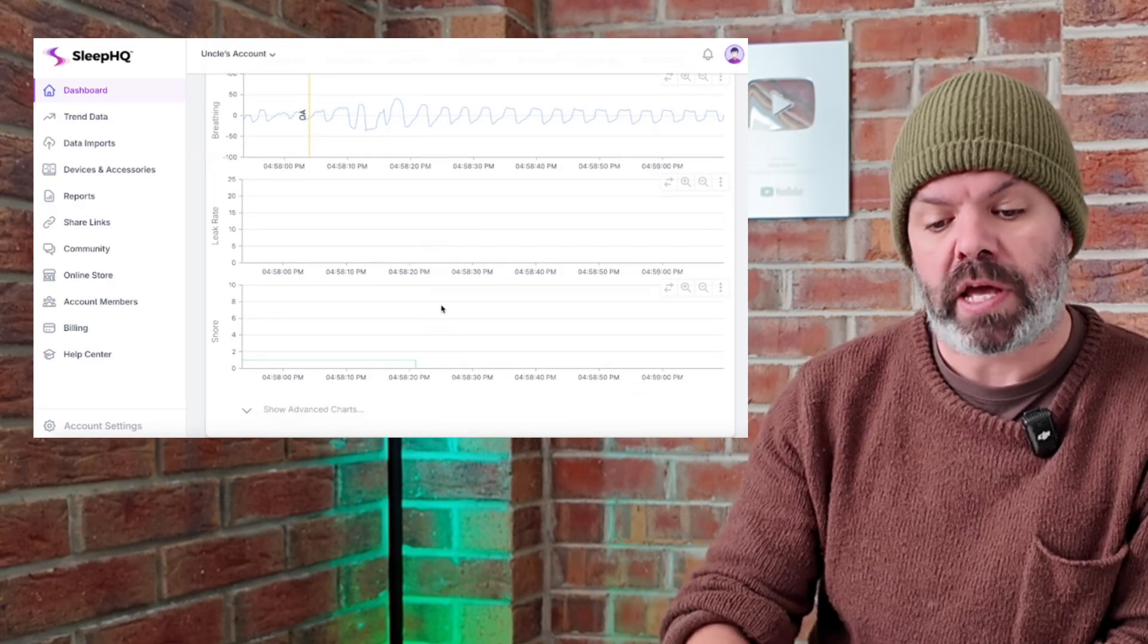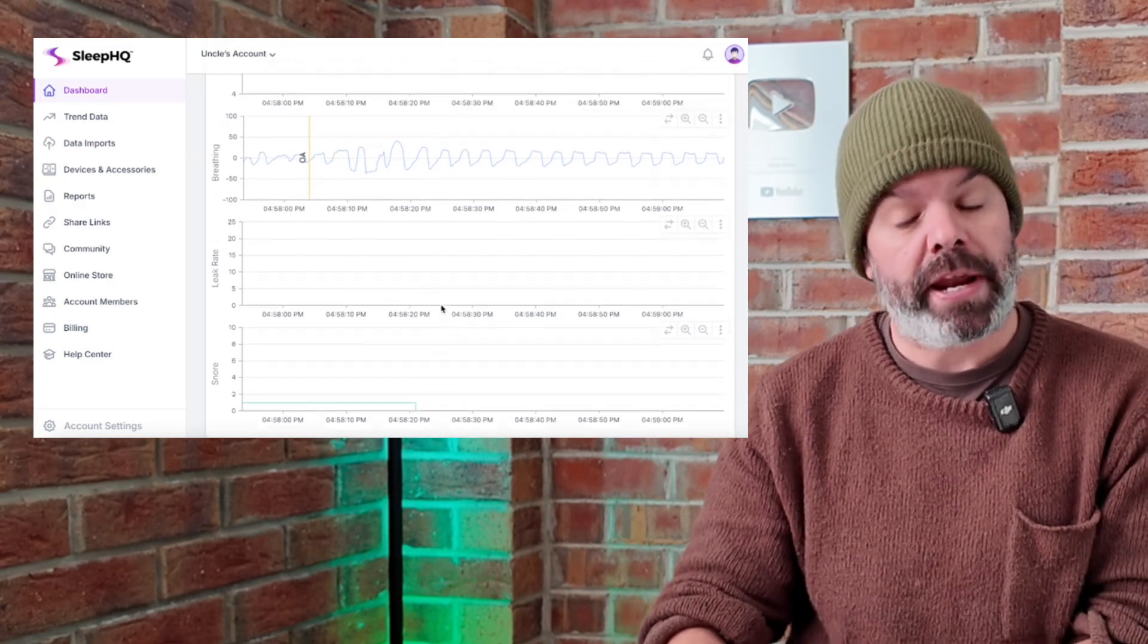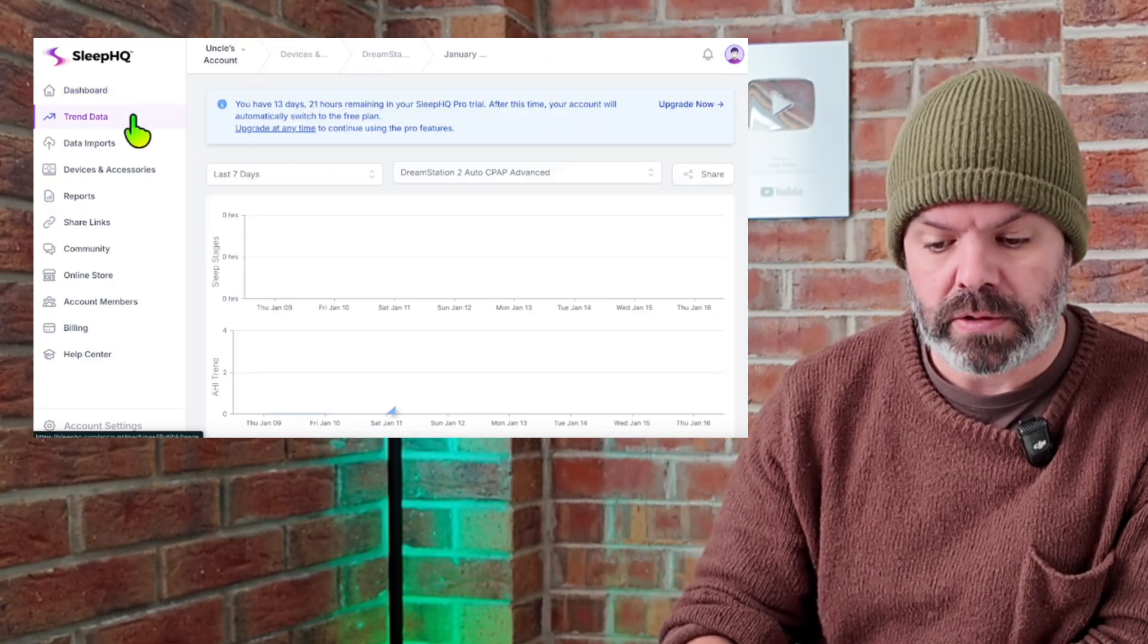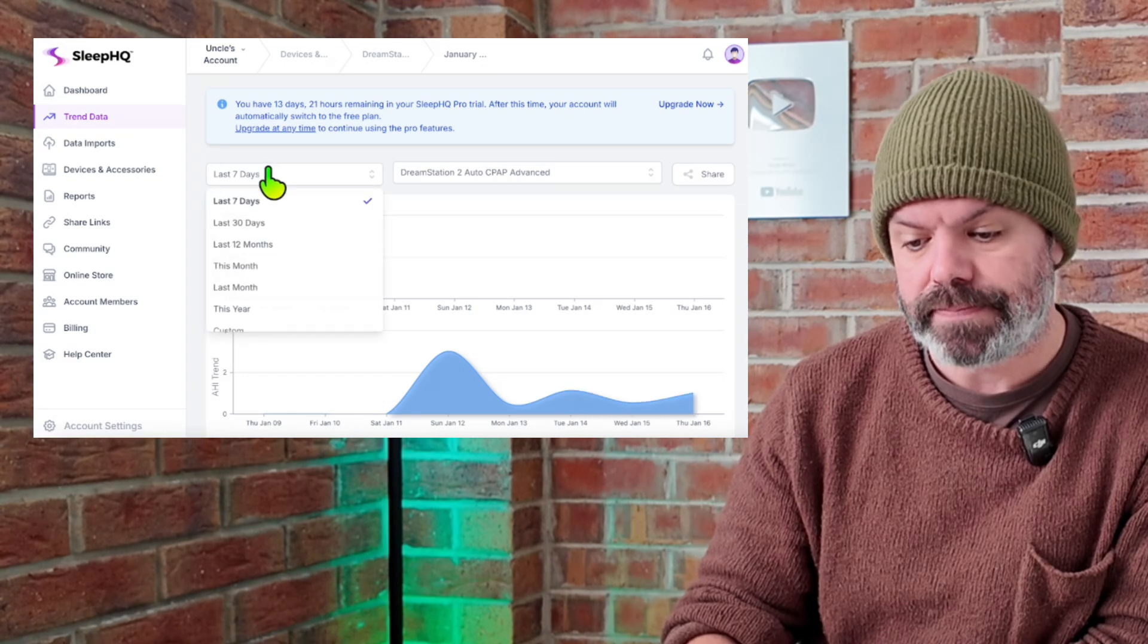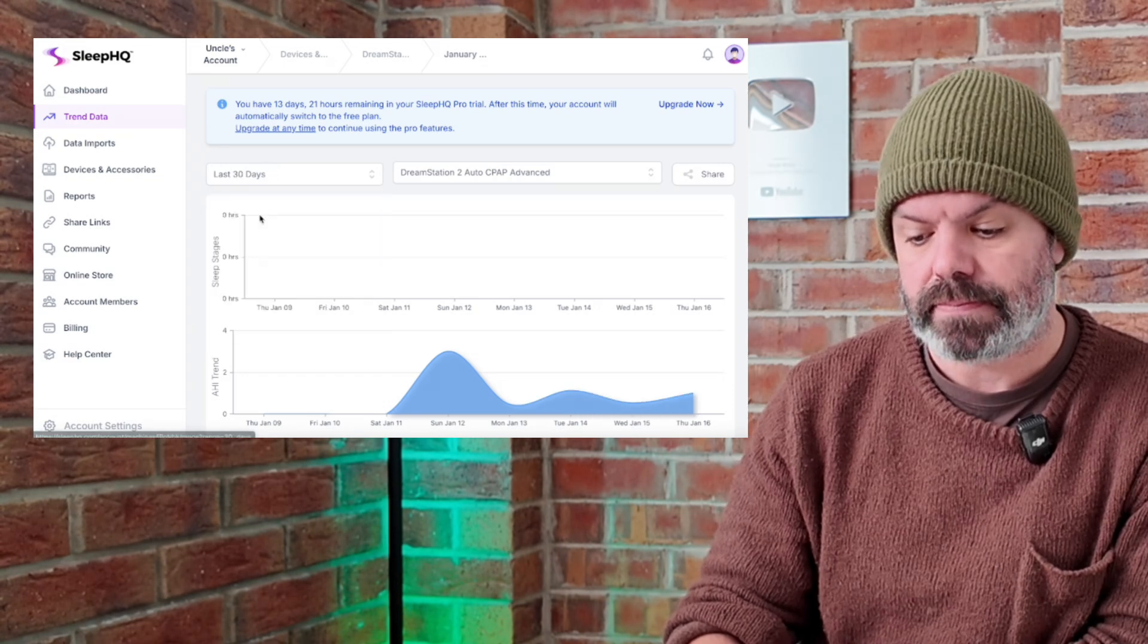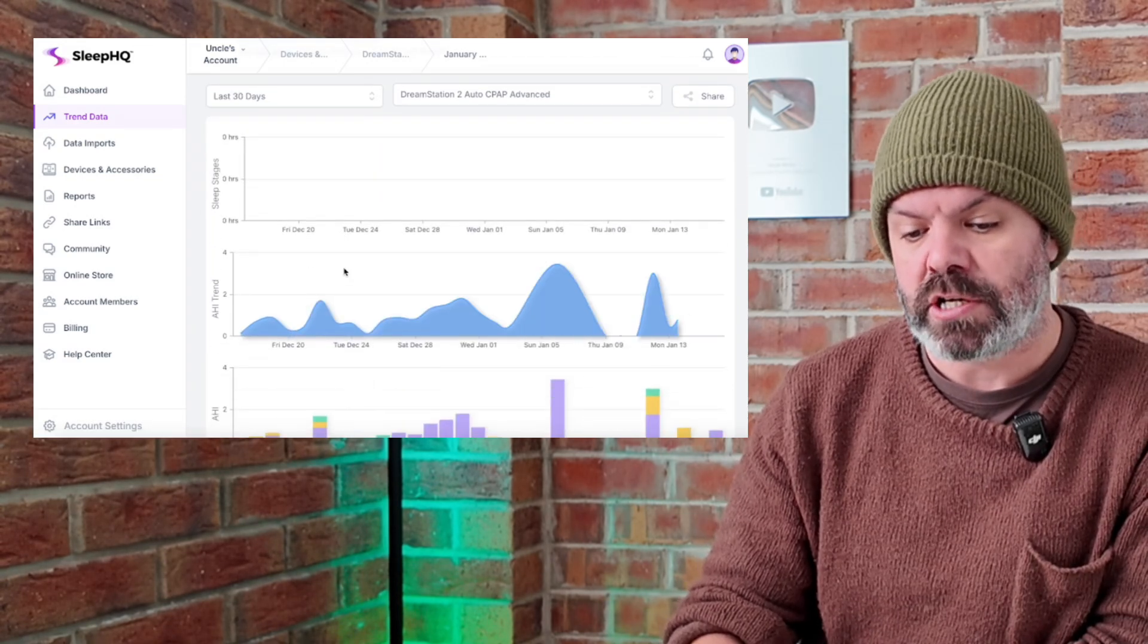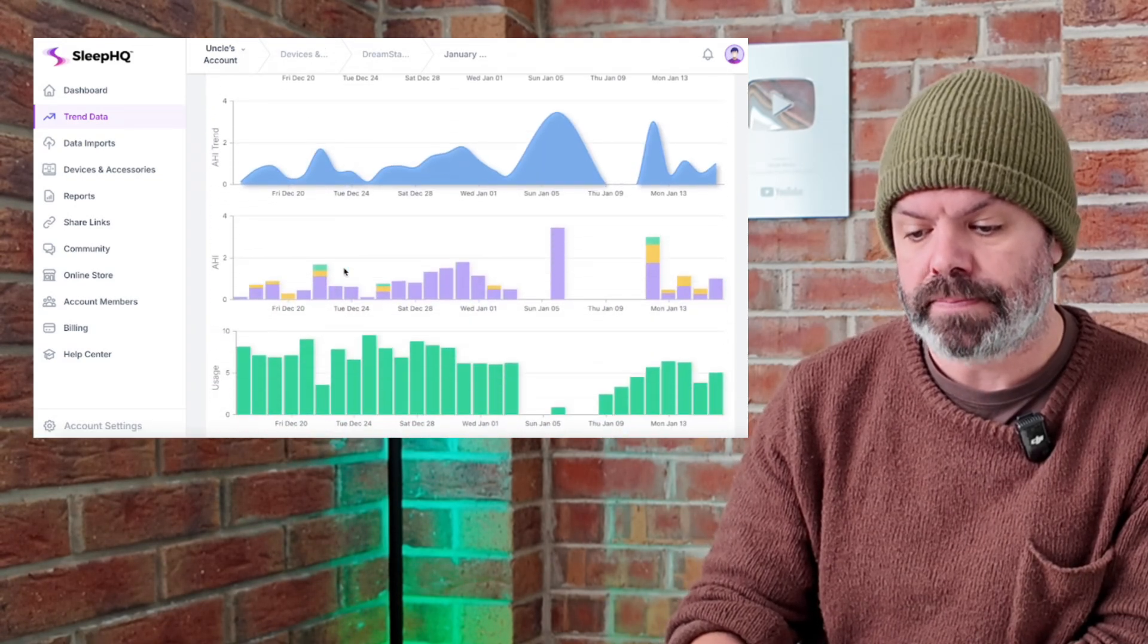You can also come over here to the trend page and we can look at trends. It's the AHI trending over time.